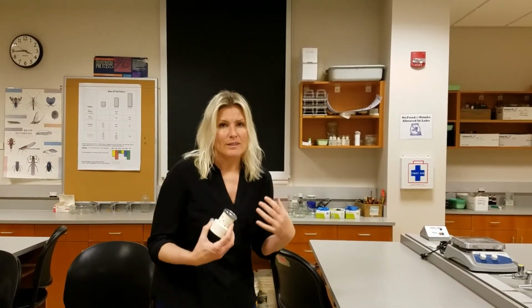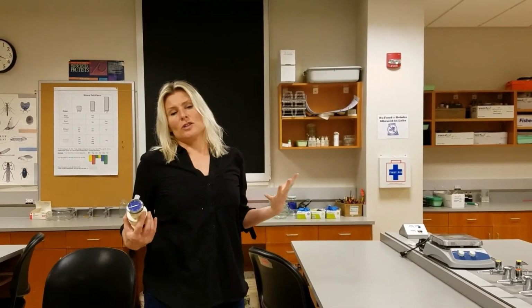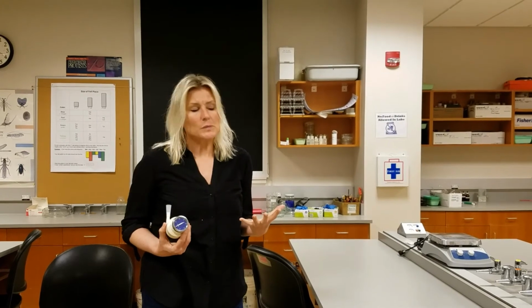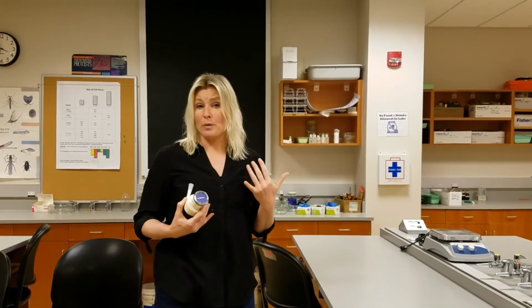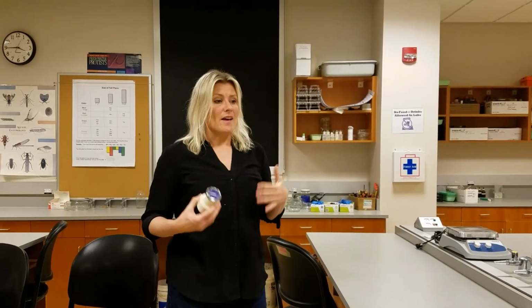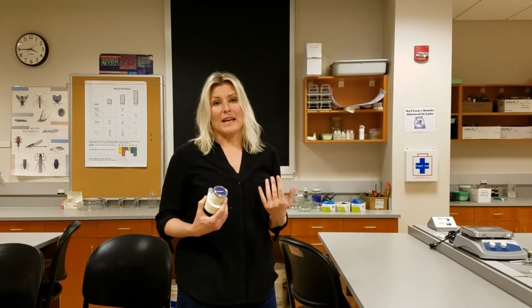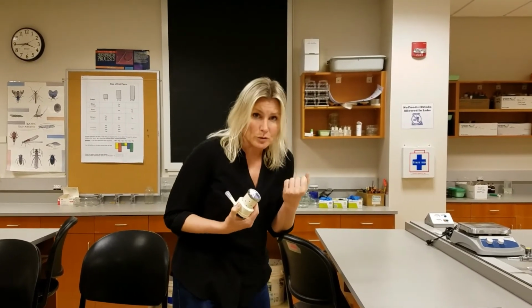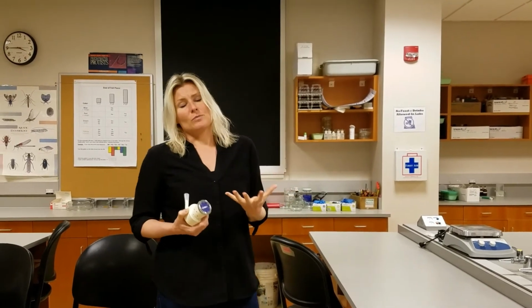When you're sitting down, some of you have bad posture, we're slouching, and you're not going to be able to measure your full lung volumes. Because we're trying to take a deep breath in, as big as possible, it's good to stand up. Then I'm going to empty as much out of my lungs as I possibly can, so it'd be helpful to do a little crunch or bend over to really squeeze as much air out.